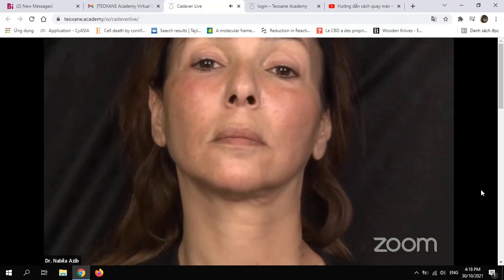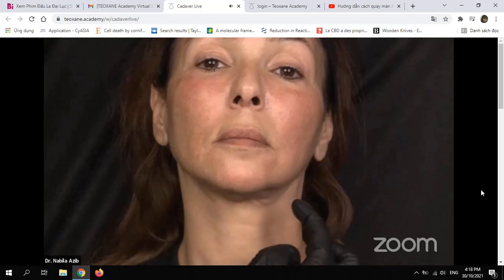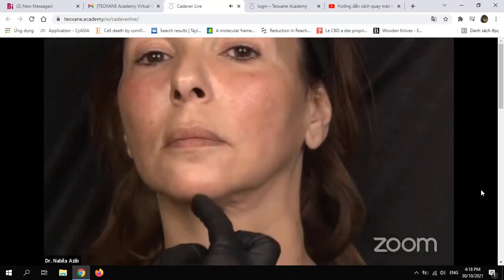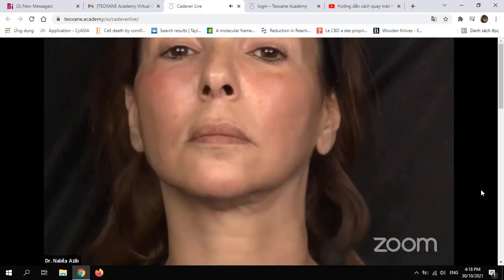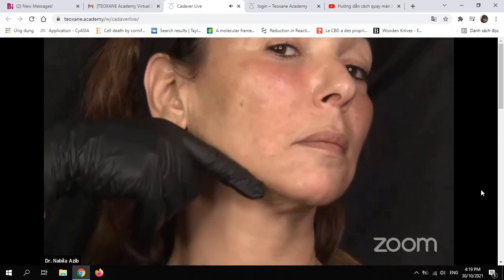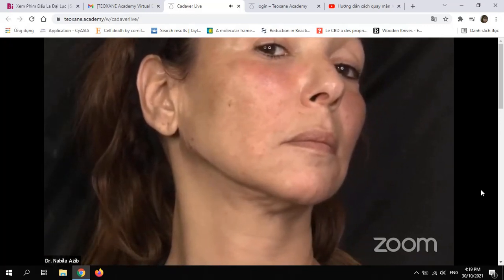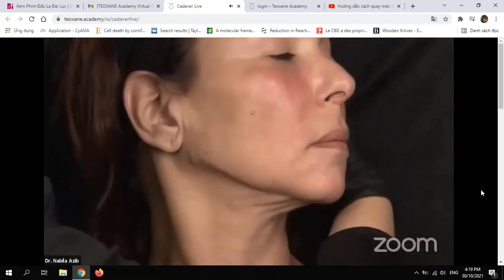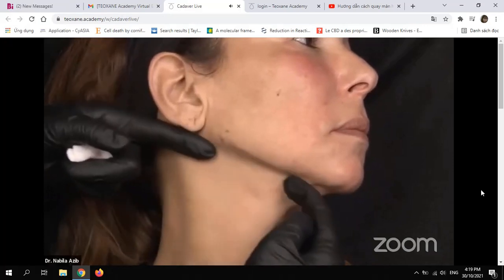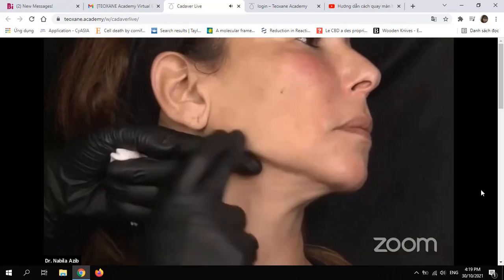Okay, thank you. So now you can see in front of you that on this side she has like an S, a wave, we can see curves, yes. And here you don't see the curves anymore and you have a better defined jawline. Yes, we can see a perfect straight line. And on a profile view, you can see that now we have these shadowings created on her neck also, so we have again a better definition.